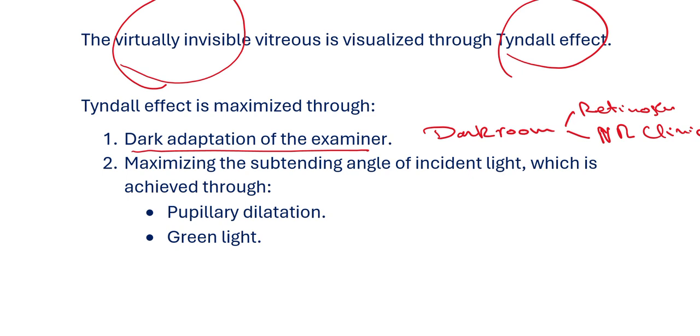So if you can imagine that you have this biomicroscope, and this is a light arm, and then you are casting light over the retina.